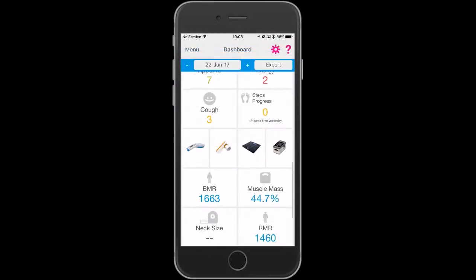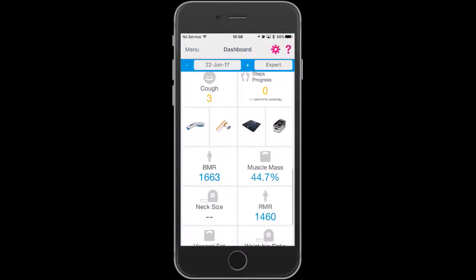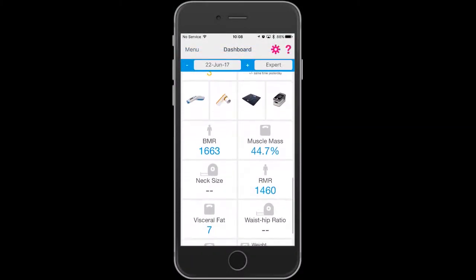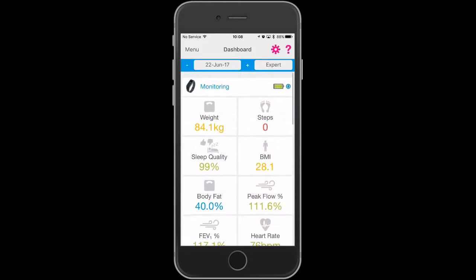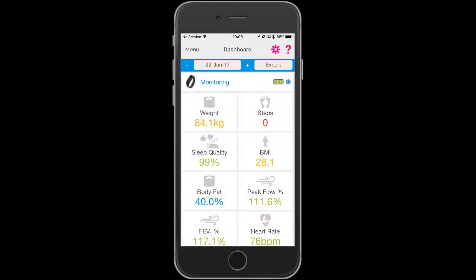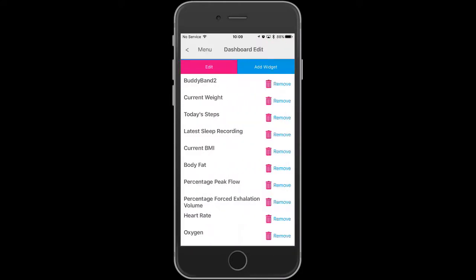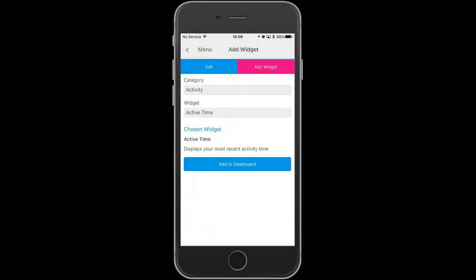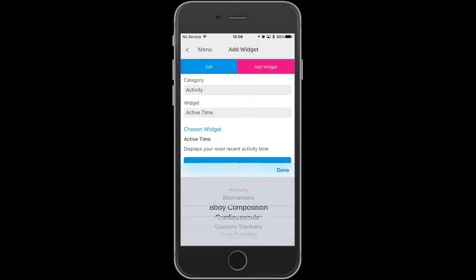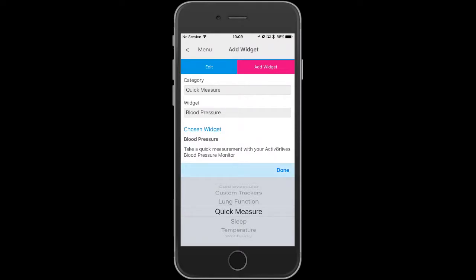To add a quick measure widget to your dashboard, you need to touch the pink cog in the top right-hand corner, then select add widget. From the category options, select quick measure and confirm done.